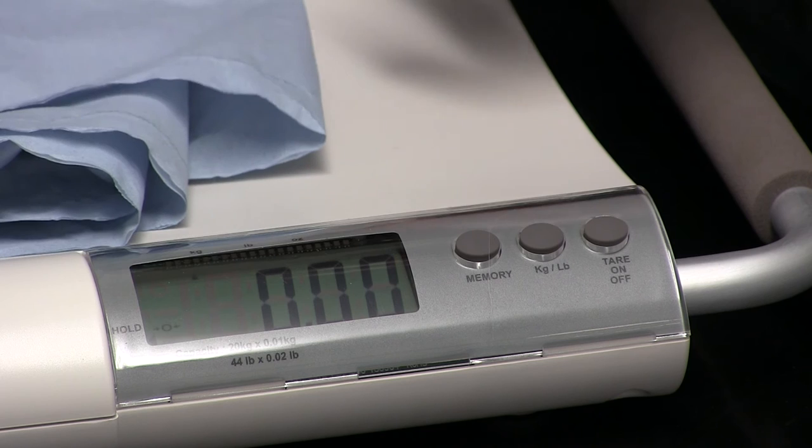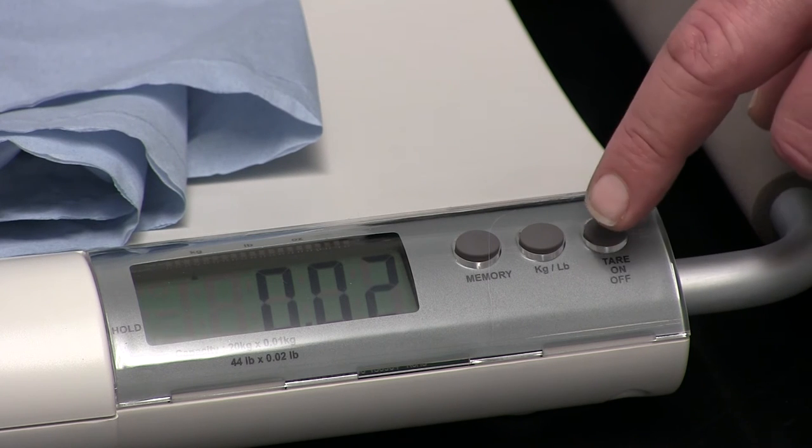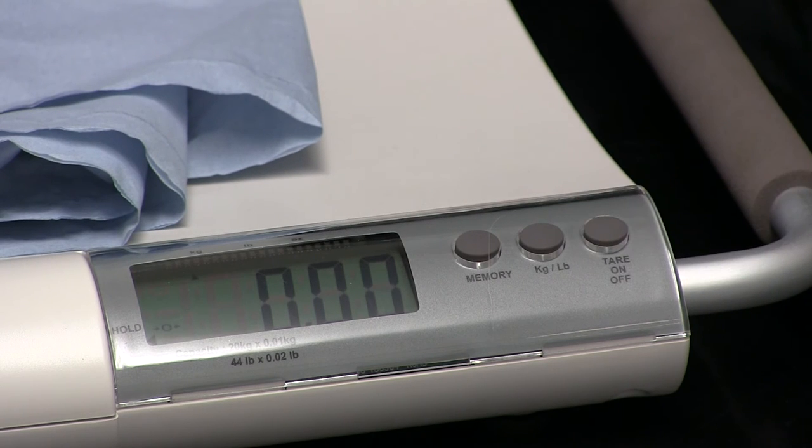Of course, all animals get nervous at the best, but the V20 comes with a tare function, meaning you can place some waterproof padding on the scale and press the tare button to take the weight of that padding off. You're then free to place your animal on the scale.